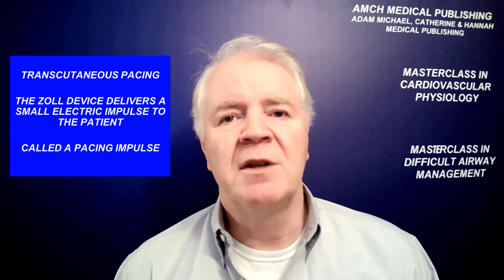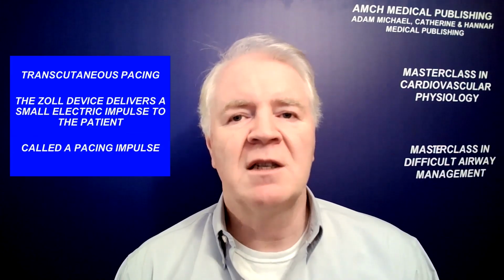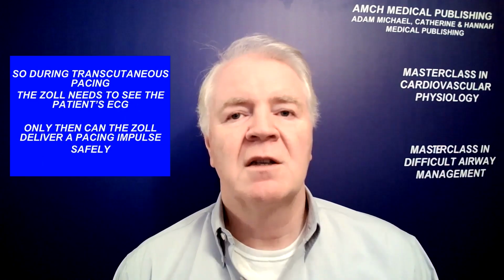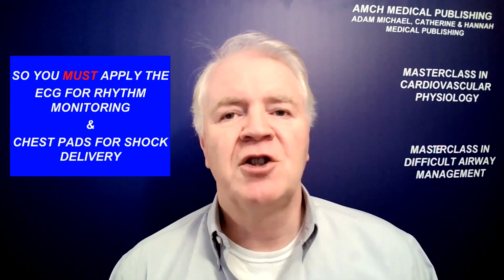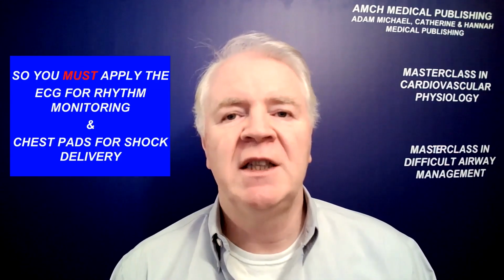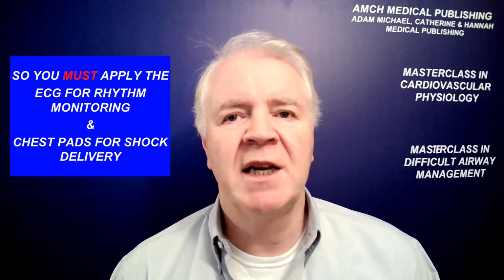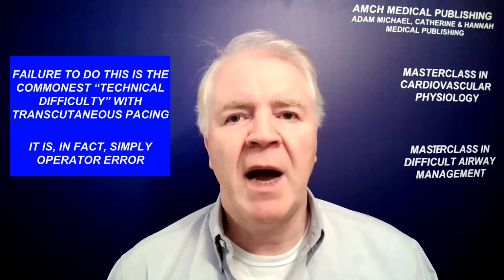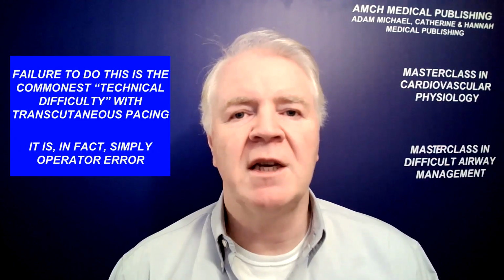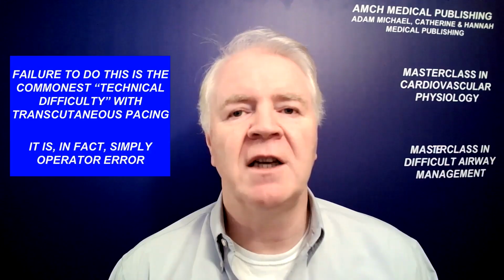By now, the Zoll multifunction device should be available for transcutaneous pacing. This is a very important skill. Successful pacing requires both pacing pads on the chest, and you must also attach a 3-lead EKG for monitoring. You cannot perform both tasks with just chest pads. For emphasis, the pads alone will not pace and monitor the ECG at the same time. This is the single commonest cause of failure to deliver pacing current.